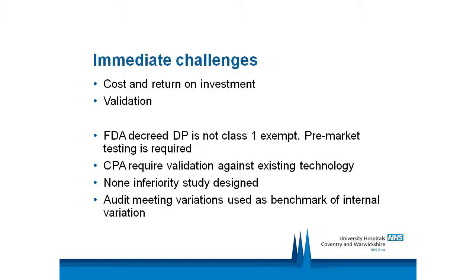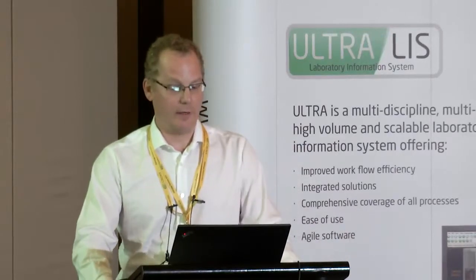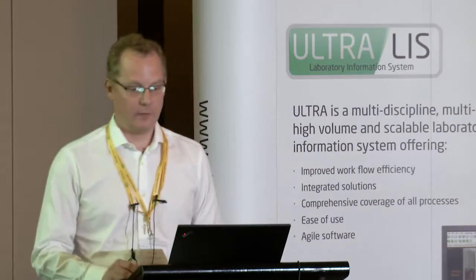At the time that we took this on, the FDA had decreed that digital pathology was not Class 1 exempt and required pre-market testing before it could be incorporated. Now, it's still the situation in the US. The UK doesn't have an equivalent to the FDA that covers diagnostic instruments of this type, but CPA, or UKAS as it now is, would require validation against our existing technology, as they would with any new development. And so we designed a non-inferiority study to prove this validation.